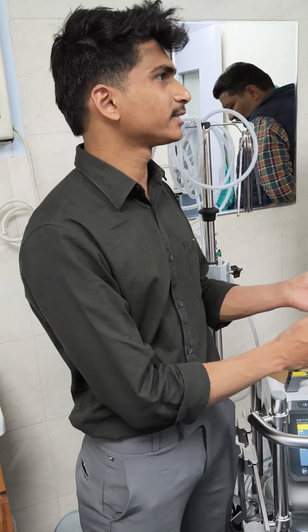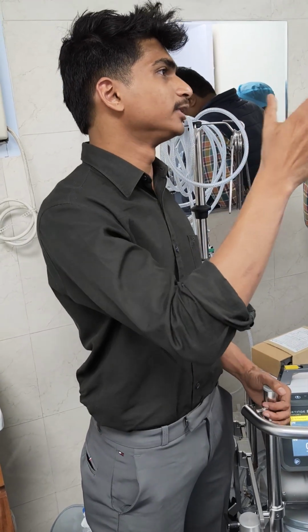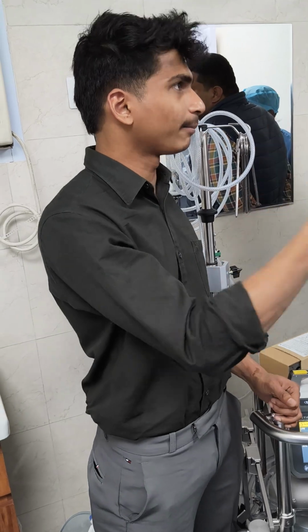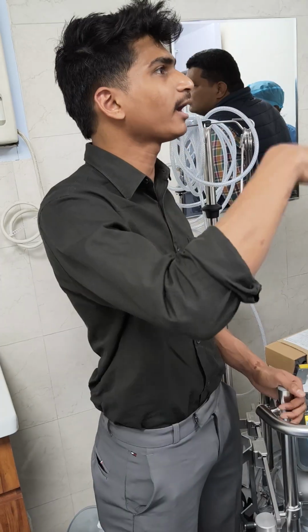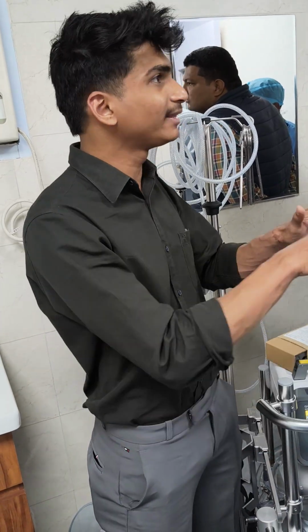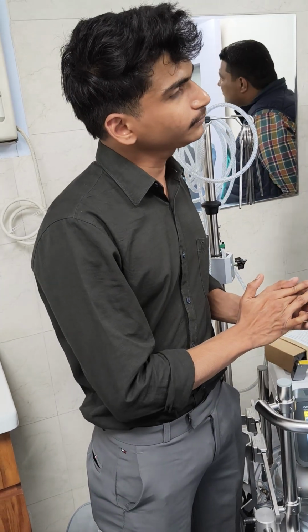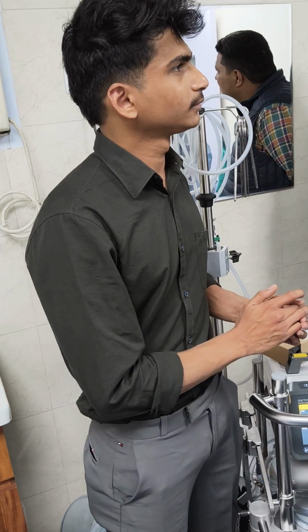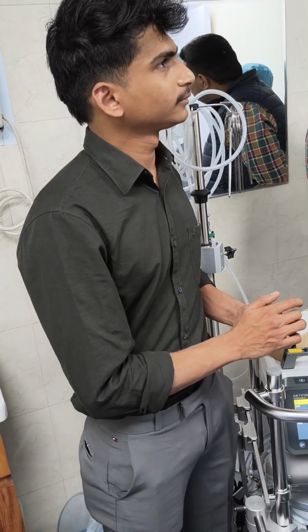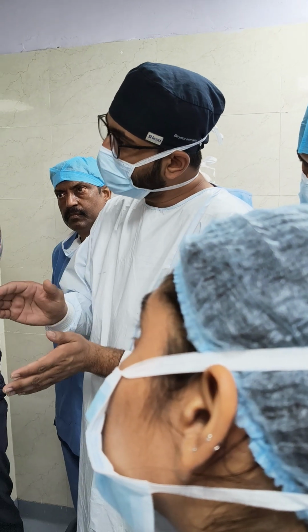Agreed. Any change in the patient, even SVR, contractility or the pressure, the flow varies. So there will be a higher fluctuation in RPM to maintain that flow of 3 liters. That's the basic principle. But I'm asking, whenever we start the management, the intervention, does it depend on the RPM or the liters per minute?